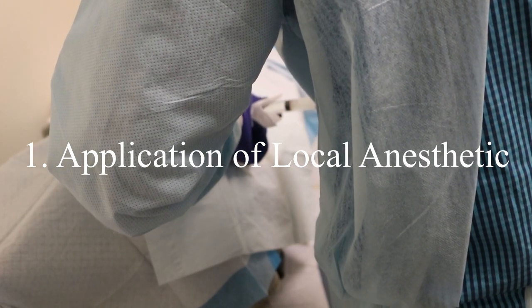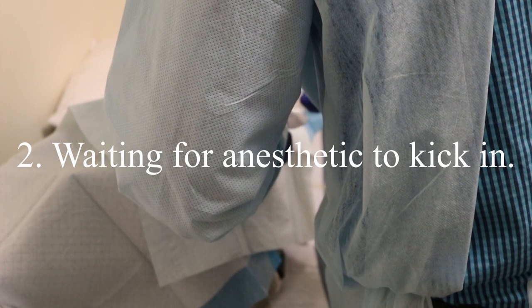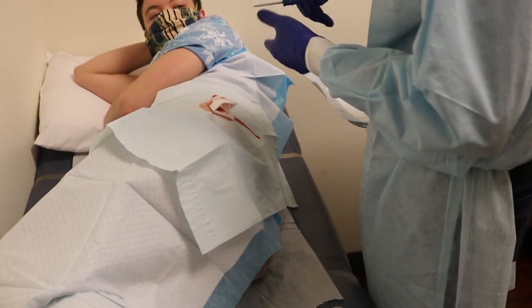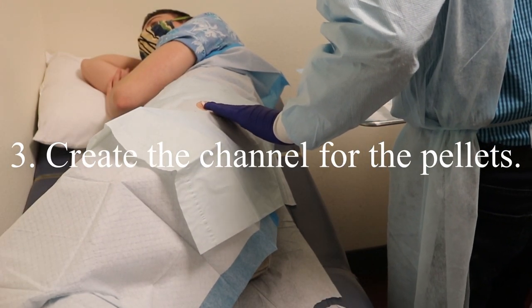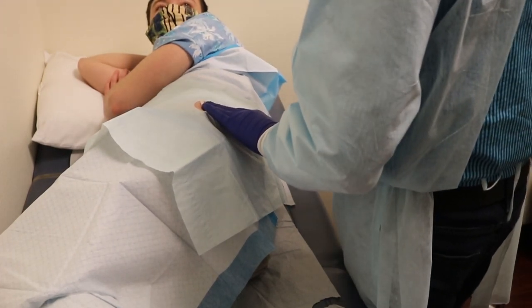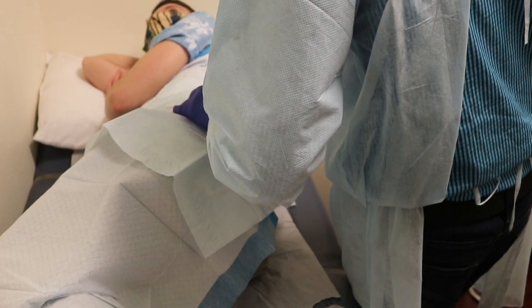The procedure begins. The patient confirms it doesn't hurt. The doctor explains he is infiltrating the anesthetic along the different tracks. He describes the tool: it will go in and create a track, and once the track is made, the pellets are loaded in and inserted. The doctor checks in — the patient says there's a little pressure but no pain. The doctor confirms that pressure is okay as long as there's no pain, and offers to numb it a little more if needed.